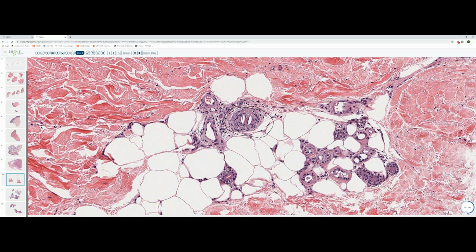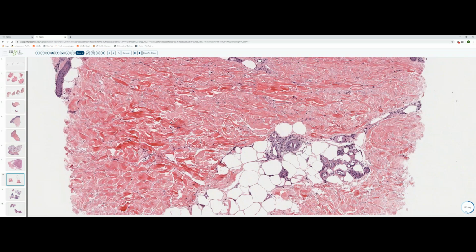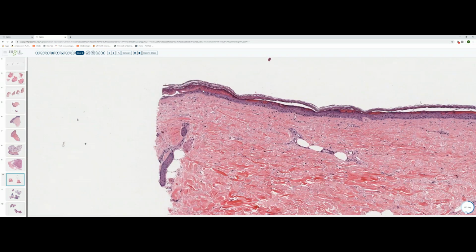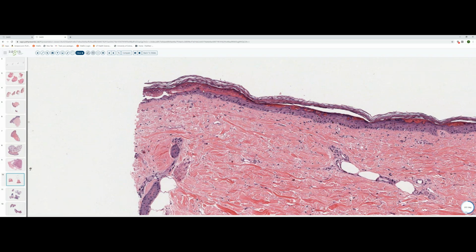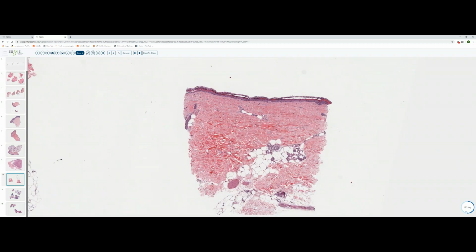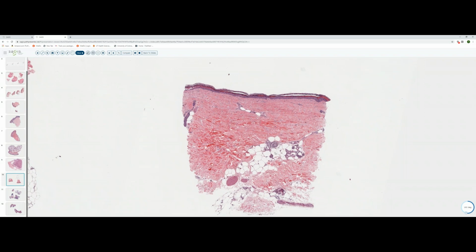Sometimes you'll see necrosis of the eccrine coil, because that's obviously very subject to anoxic influence. And then frequently you'll see subtle epidermal necrosis, a lot of times hemorrhage too, because the lesions can be purpuric. But this was an example of a cholesterol embolism.